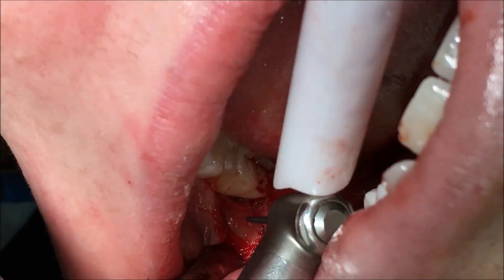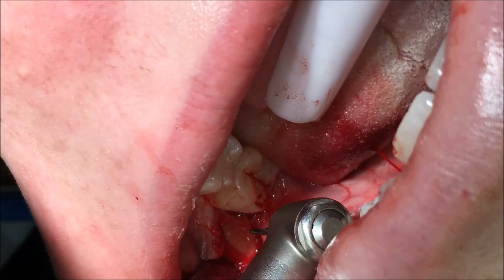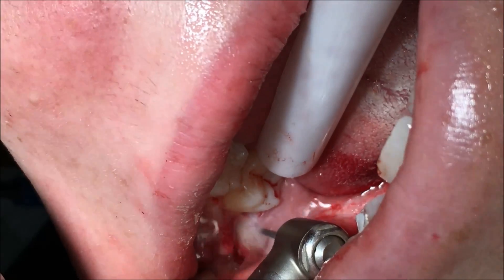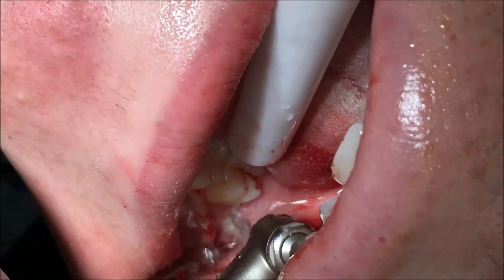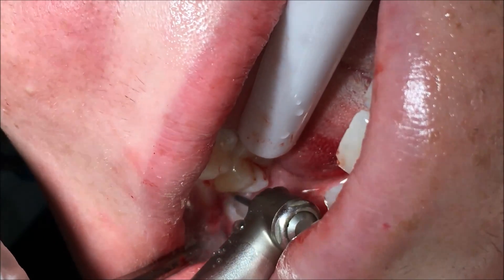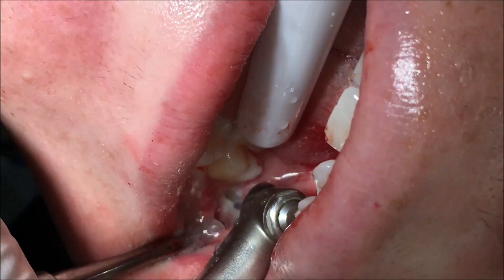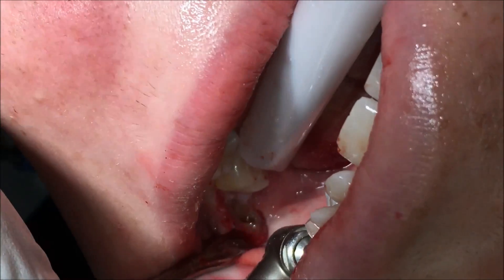Once we've exposed enough, we can start our bone removal. I'll start mesial first and remove a good amount of bone to actually expose the tooth — it's still impacted under quite a bit of bone there. This is a fairly wide gutter compared to what I normally do; we're going for about 2 or 3 mils of bone removal here.